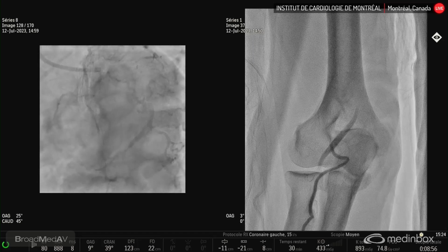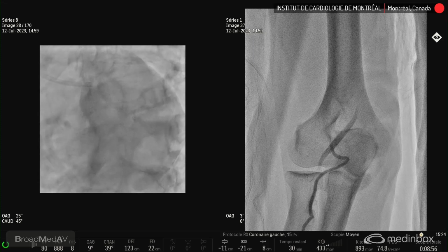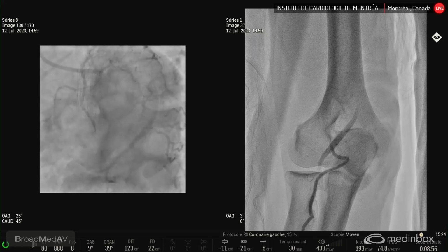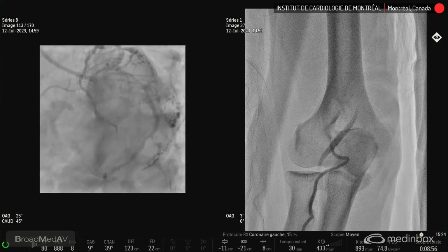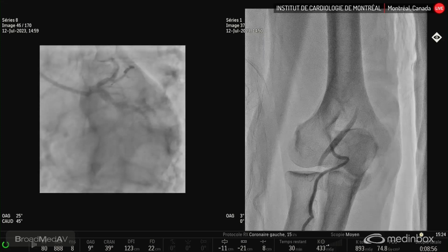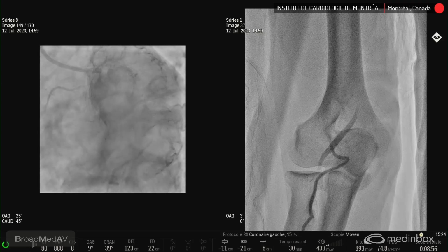So we decided we were going to go ahead and do the angioplasty of the LAD, very calcified. We wanted to do OCT. So we tried to open the vessel a little bit with a 2.0 non-compliant balloon. And we perforated 2 of these balloons, showing us that this was extremely calcified superficial calcium and could not dilate. So lithotripsy would not be an alternative as of now. So we switched plans.